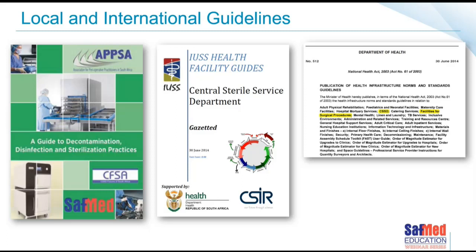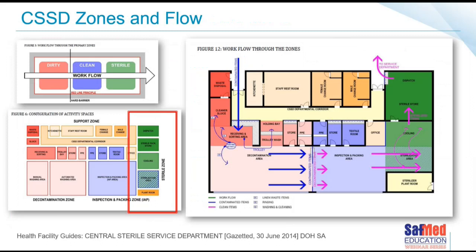Again, it's not in a single downloadable PDF format at all, but there are sections that you can scroll through on the internet that you can go and look at to look at some of these guidelines. So very important if you're doing a new build, or if you're revamping your CSSD, or if you're trying to understand how your CSSD is supposed to be designed and laid out, an important document to consult. So one that we use often. We have the privilege often of consulting with architects when they're doing a new build or a revamp, and that's of course the go-to document that we will use in the South African setting. So those are our published guidelines.